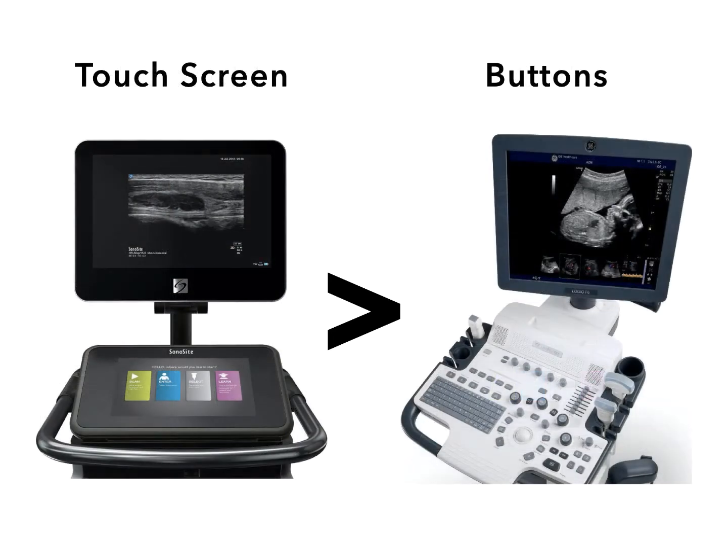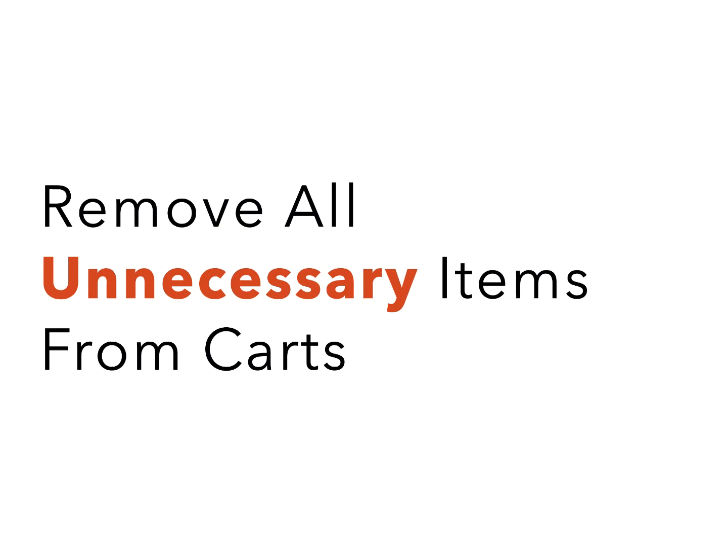If you're planning on using a cart-based ultrasound, use one with a touch screen instead of one with multiple knobs and buttons. You can imagine if you're in a room where an aerosol generating procedure is taking place, viral particles could find their way into all the crevices of the machine. Remove all unnecessary items from the cart like printers, baskets, and extraneous cords. It's ideal to scan these patients using a machine's battery power rather than plugging into a wall outlet.